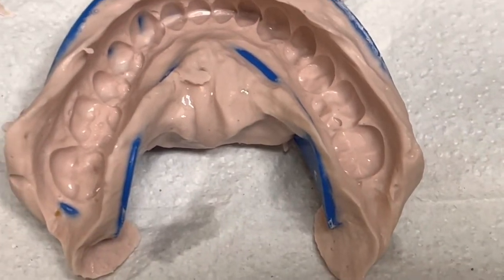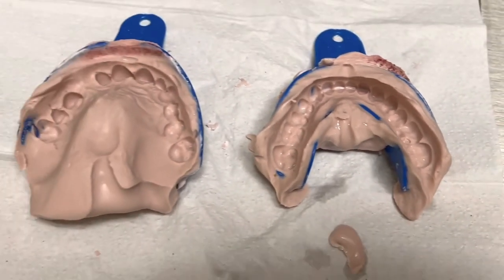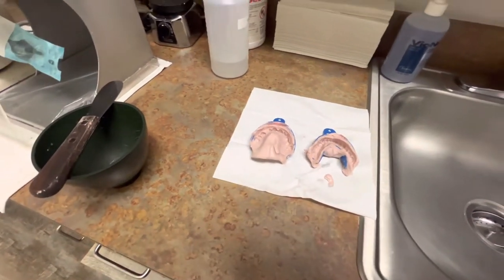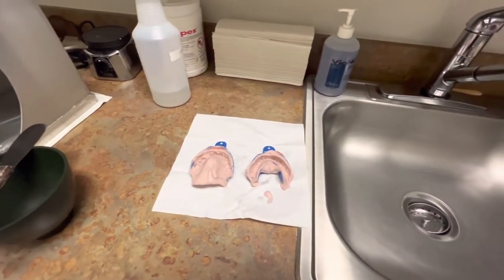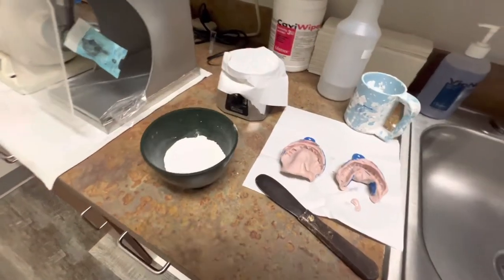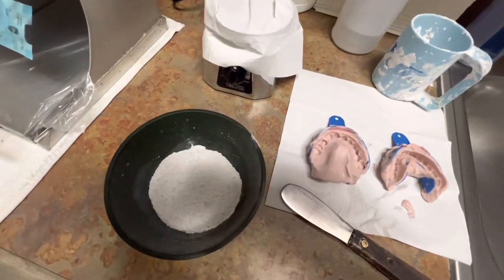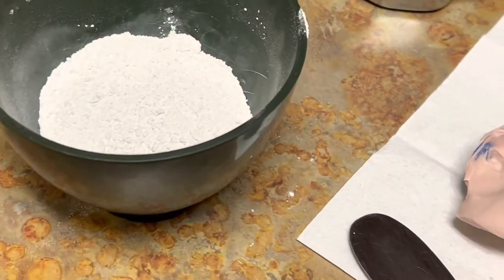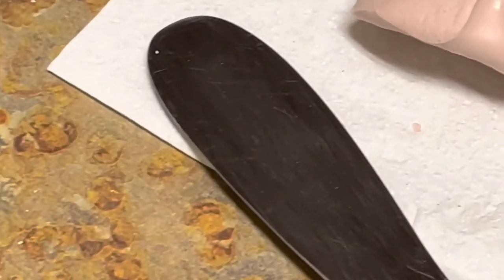I took these impressions and I am going to be sending them out to the laboratory for a stay plate of number 11. So I'm going to get my setup ready and grab some stone. Before you pour up the impressions, it is very important to make sure you dry them up first. With an air and water syringe, just make sure the impression is dried up, which I already did.